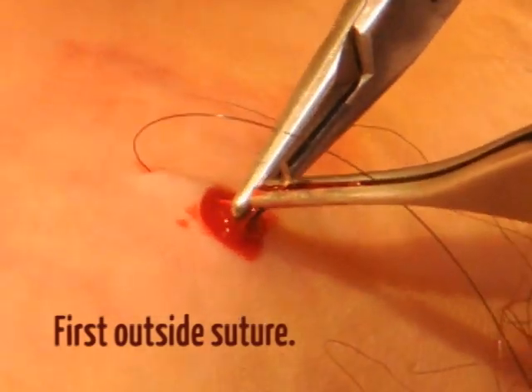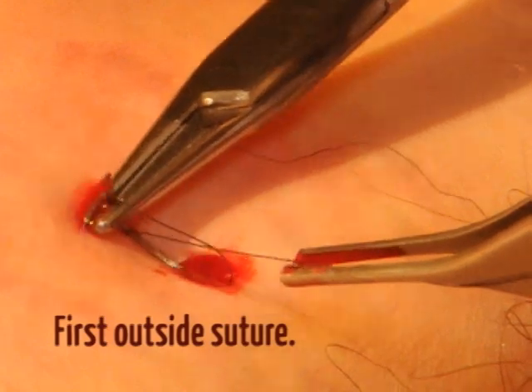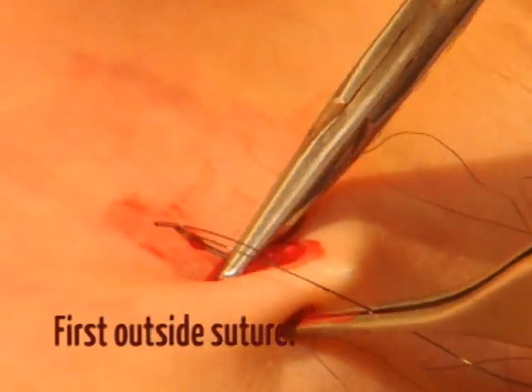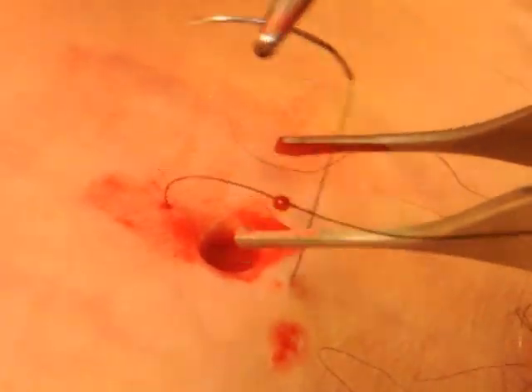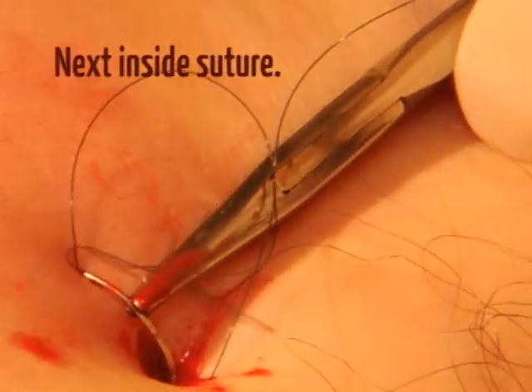The first entry point is 5 to 10 millimeters from the wound edge. The suture is then brought out through the skin the same distance from the wound but on the opposite side. Next is the inside portion of the suture.